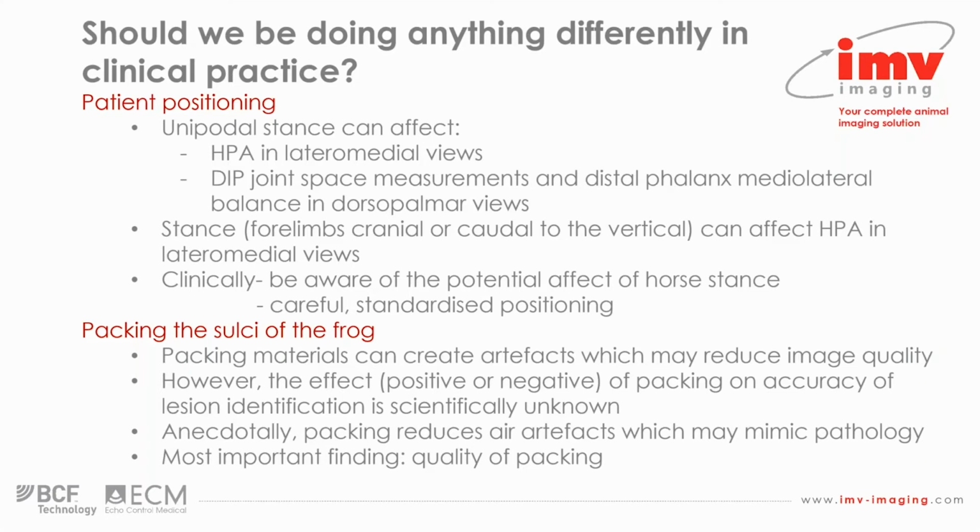Finally, for packing the sulci of the frog, packing materials can create artifacts which may reduce image quality. However, the effect, whether positive or negative, of packing on the accuracy of lesion identification is currently scientifically unknown. However, anecdotally, packing does reduce air artifacts which may mimic pathology. And my takeaway is that the quality of packing is essential.